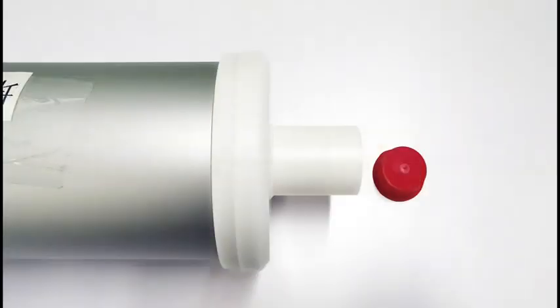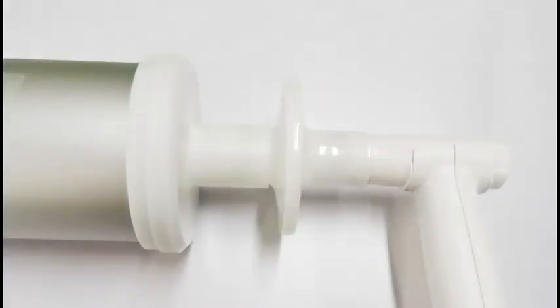Remove the red sealing cover in front of the calibration barrel and connect it with the handle of the filter. Ensure that the links are tight and there is no air leakage.